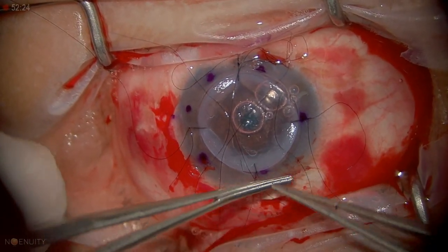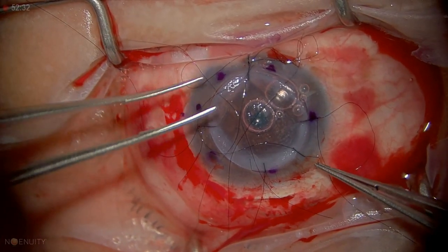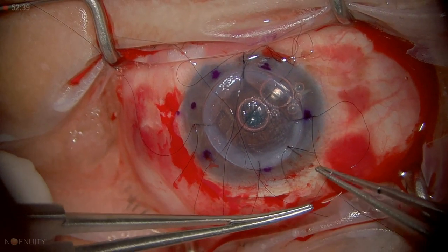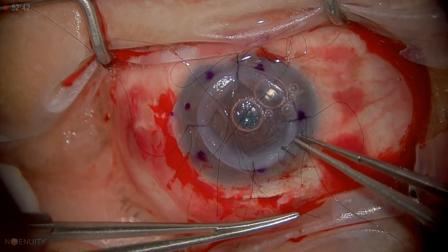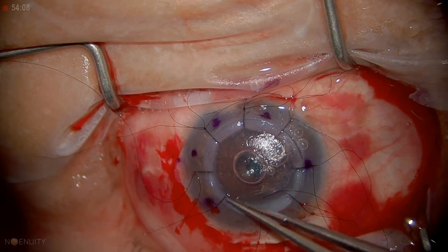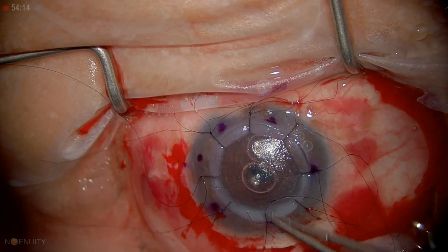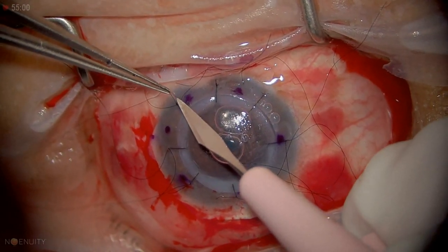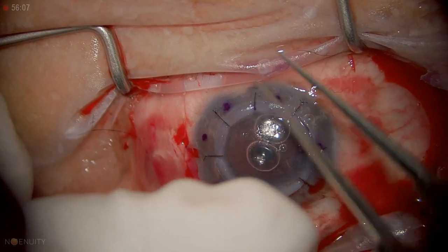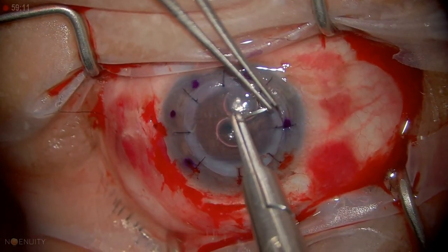We want to crank them down — we're going to have eight interrupted. I'm going to put one more through the scleral tunnel and one to close the conjunctiva, and then use a running suture to finish it off. You have to learn to crank them down and use locks effectively so they don't open. We've got all our interrupted sutures. There's a little bit of a gap there, but otherwise it sits nicely. I like to leave the knots inside the donor graft, just inside — they're easier to take out that way.